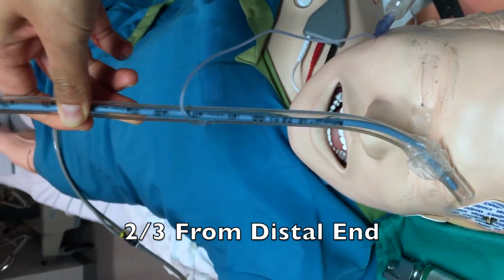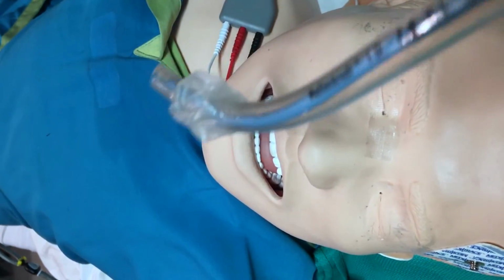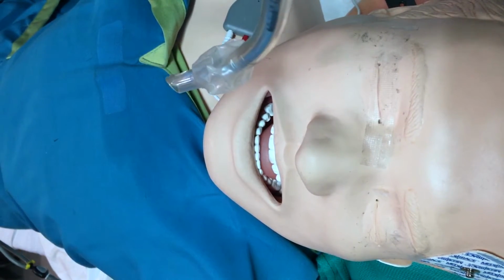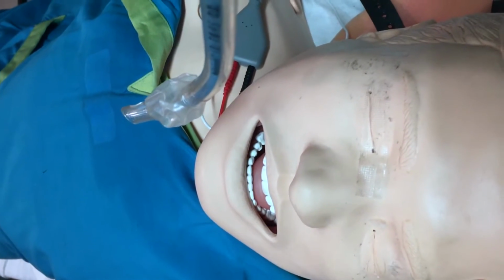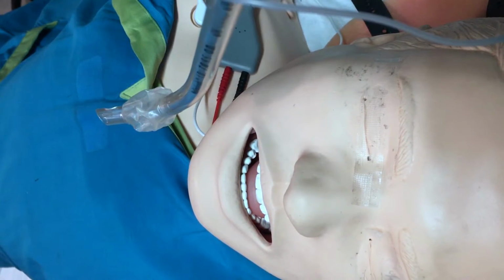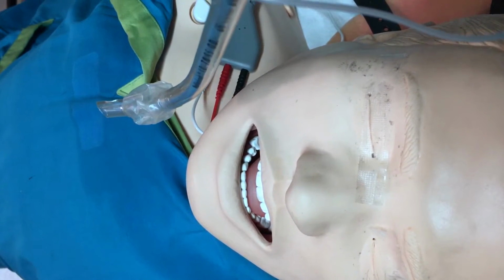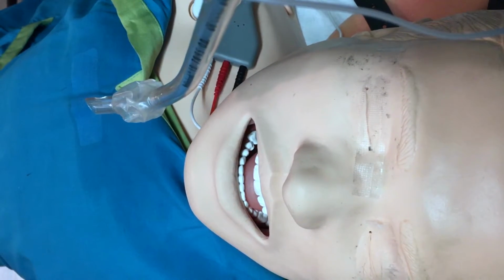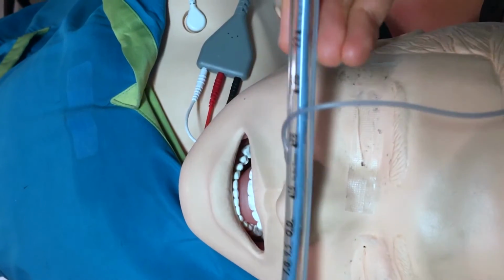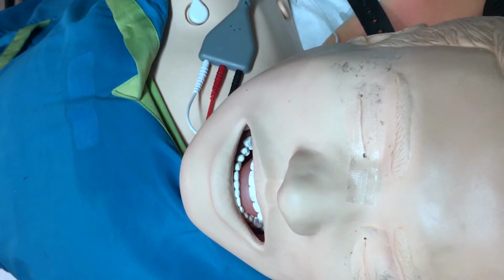So it'll be essentially like this. When you insert it, you want the hockey stick portion to be at the 3 o'clock position. And as you go in, you rotate it like this. You want to put the ET tube about 2 centimeters distal to the vocal cords. At that point, you can remove the stylet, advance it more, inflate the cuff to minimal occlusive pressure, and then give a positive pressure breath and make sure it's in the right place.